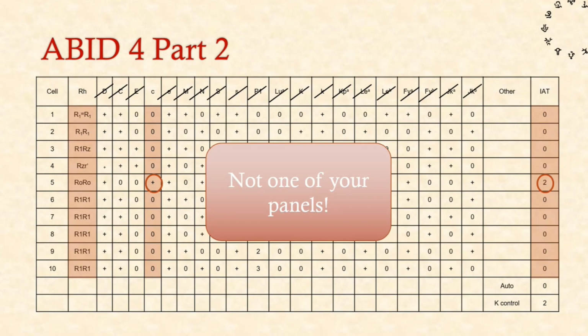So again, we're just going to have a quick close look at this panel and see what we can spot around it. So first off, unlike the little e panel, they're nearly all negative, but one of them is actually positive. And what you might notice about all of these cells is the previous one was all made up of combinations of R2, or R2 and Rz. This one is mostly an R1 panel, and this is called the R1 panel. And we'll take our naming very seriously.